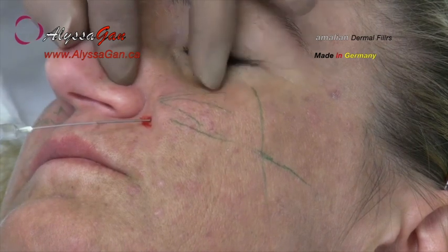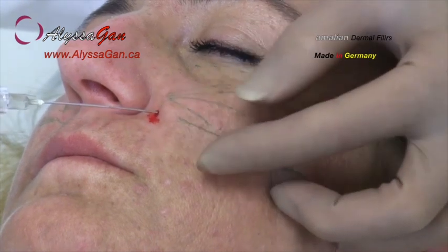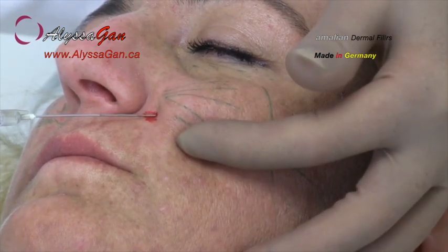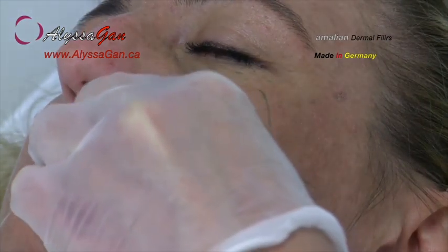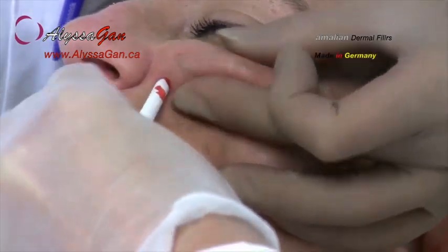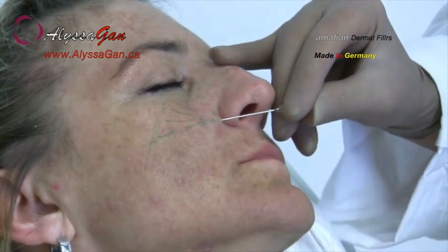The position of the implant is verified again and again through palpation, and the treatment is adjusted accordingly. After conclusion of the treatment, the position of the implant is controlled. It is important not to press it downward, but slightly upward instead. Also, in placement of the preliminary insertion, a narrow insertion angle should be chosen for the cannula.